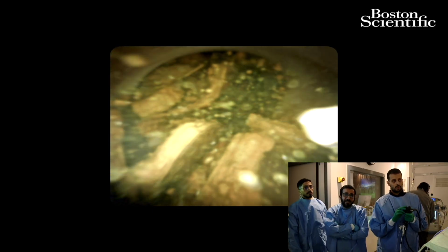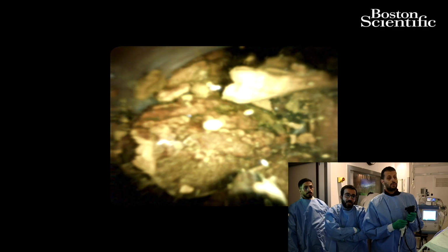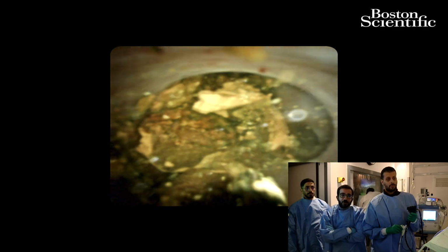We may need now to do a CRE, but not really a large diameter dilatation because we already fragmented the stone. The patient has a benign distal CBD stricture. That's what we also noticed in the earlier fluoroscopy image.